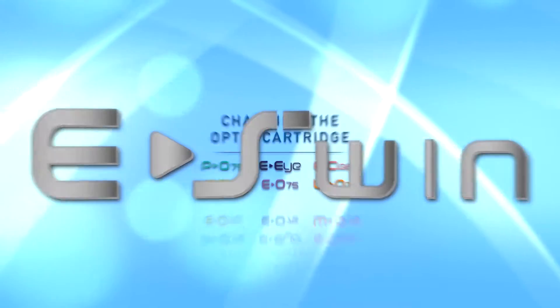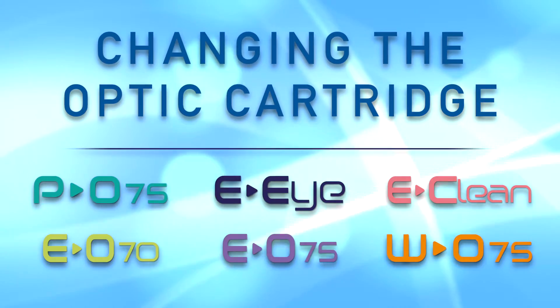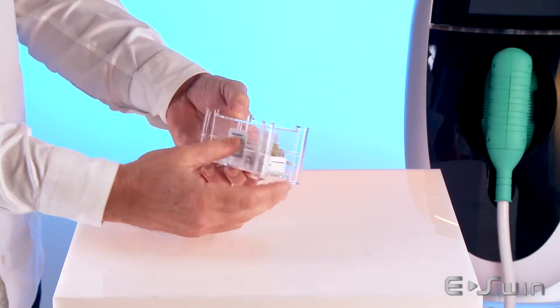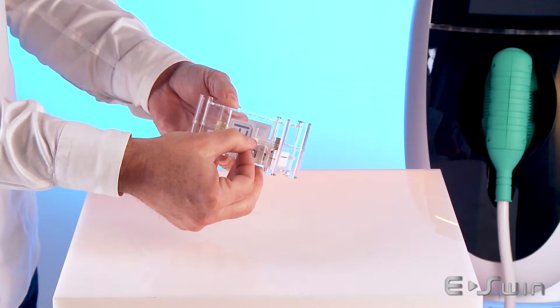Carefully follow these steps in order to replace the optic cartridge on the device shown on screen. First, open the cartridge package by cutting off security stickers.